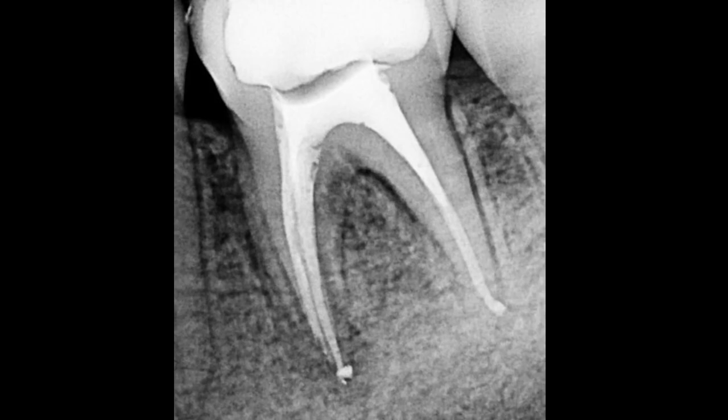After the radiograph confirms no voids are present, you're going to etch the chamber, bond, and then place a two-millimeter layer of Surefill over the gutta percha to ensure a good seal, and then continue with the restoration. In this case we see sealer to the apex of the canals, which is a good sign — no voids present. Since I did not complete the definitive restoration, we placed a cotton pellet over the flowable composite and completed a temporary restoration with Tempit material.